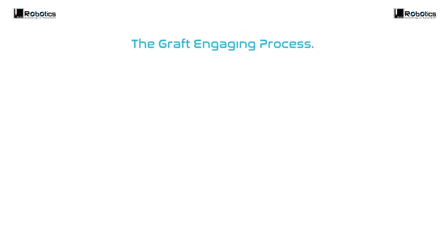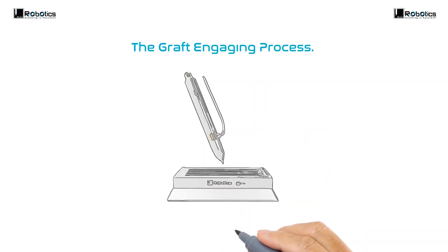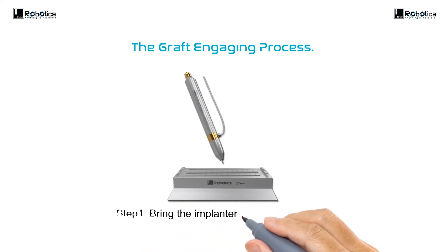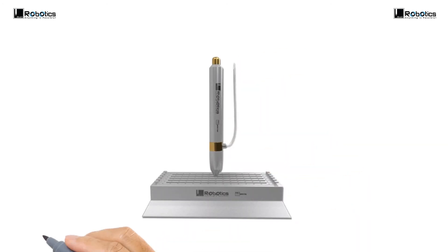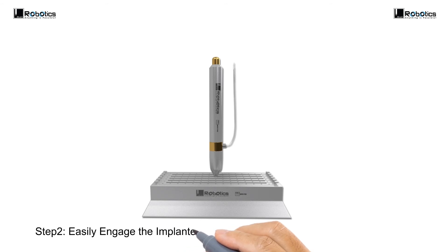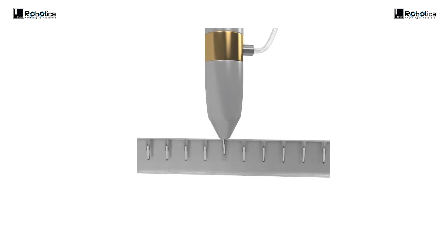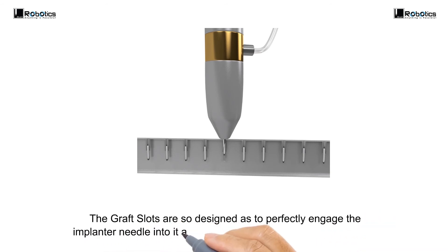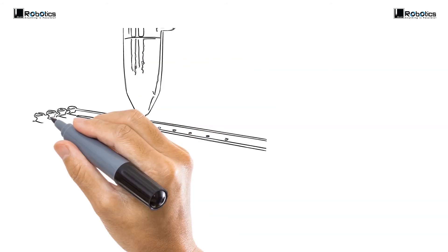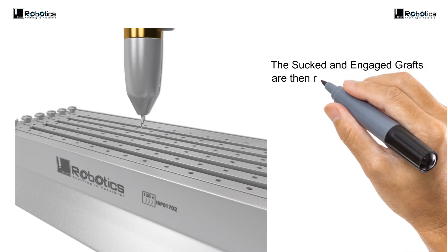The graft engaging process. Bring the implanter to the graft holder and easily engage the implanter needle into the graft slots of the graft holder. The graft slots are designed to perfectly engage the implanter needle and easily suck the graft into the implanter. The sucked and engaged grafts are then ready for implantation.